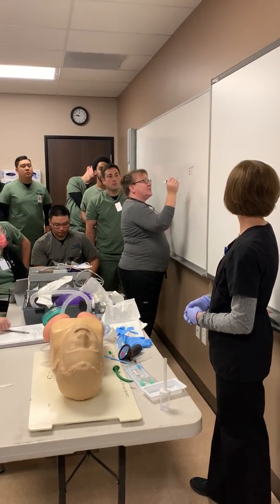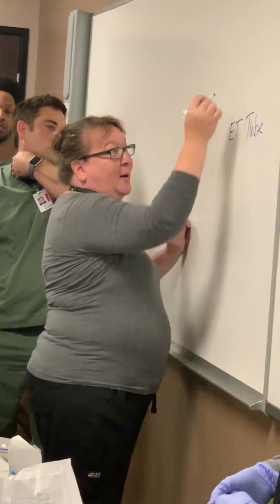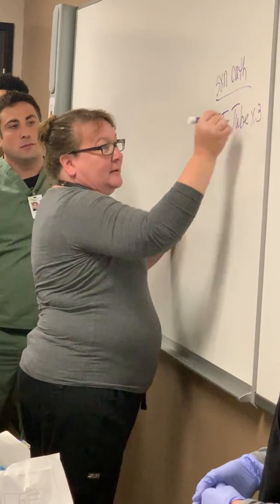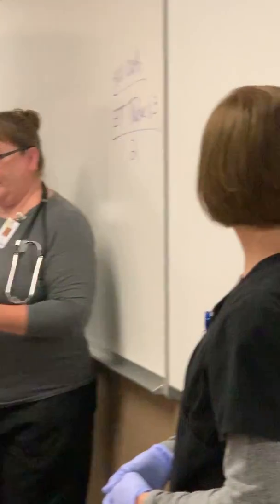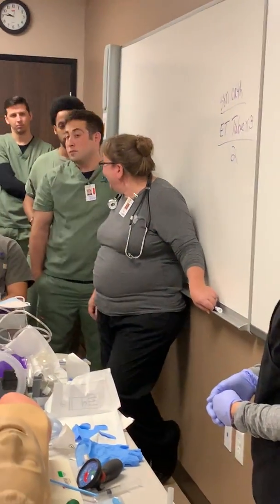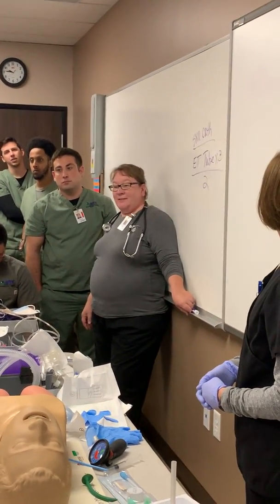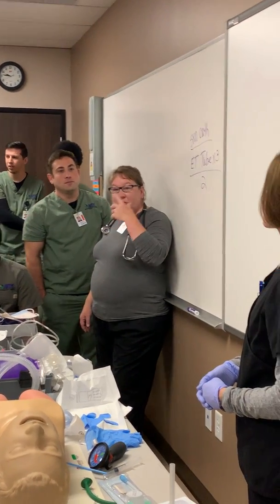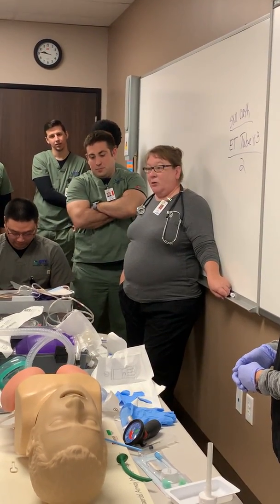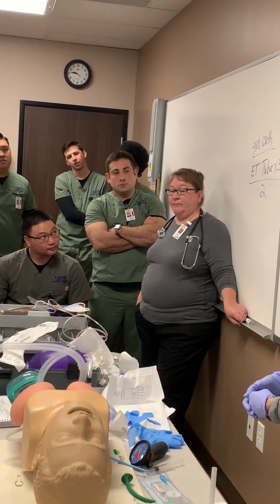For the boards, I know Mr. C told you one thing. I thought he was going to tell you this one, but the proper suction catheter size is ET tube times 3 divided by 2. Ours was times 2 minus 2, whatever it is, I don't even remember now. Use this one: ET tube times 3 divided by 2. So if your ET tube is an 8 or your trach is an 8, it's 8 times 3, which is 24, divided by 2 is 12. So you would use a 12.